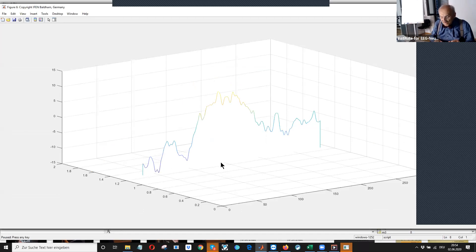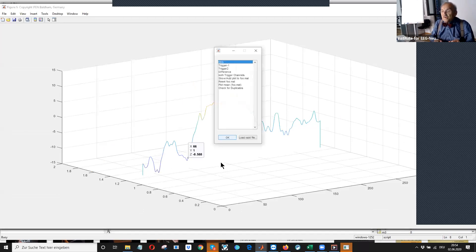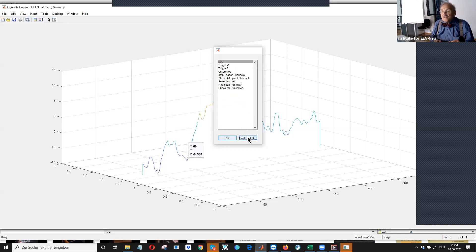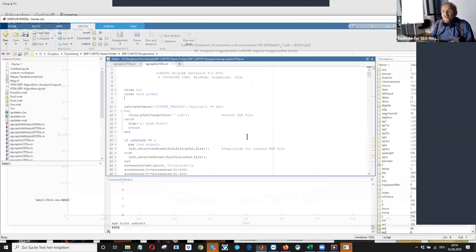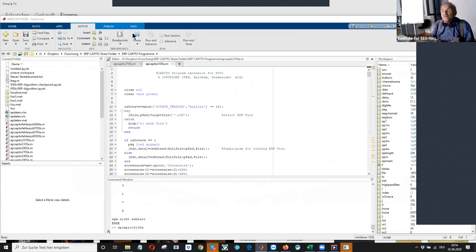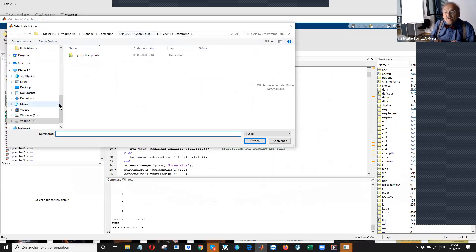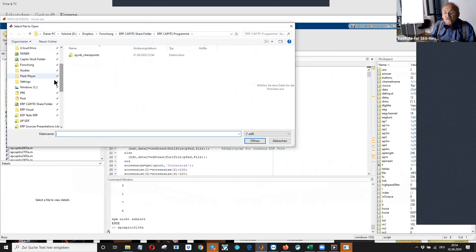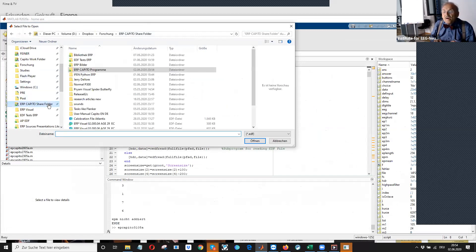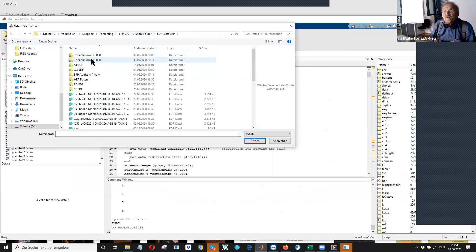Now we go to the next file. We say run. We look for our CAPITO share folder. Look for our file.